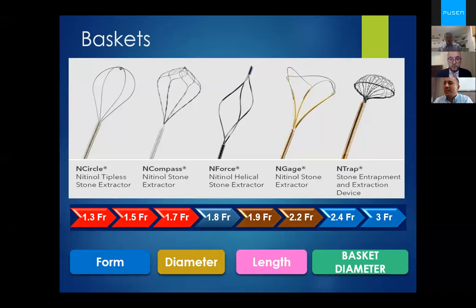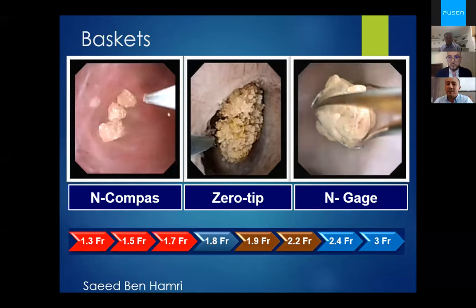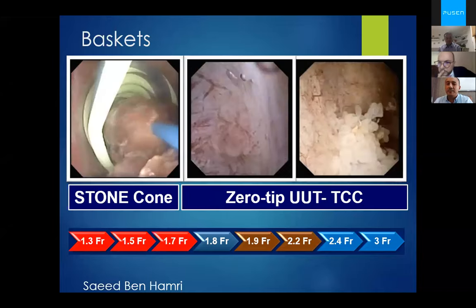Finally, the basket diameter should be more than 12 millimeters, so we can catch any stone of 1 centimeter. We can see here different types and designs of baskets.